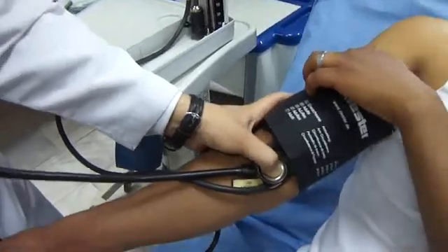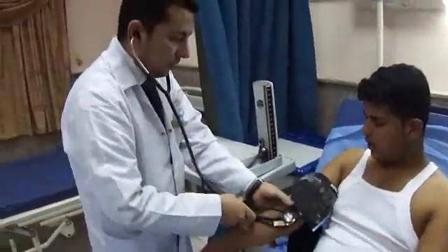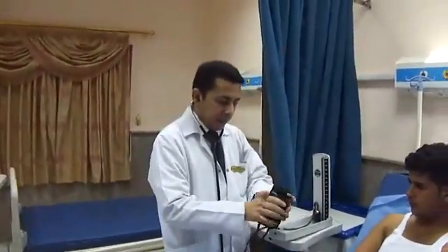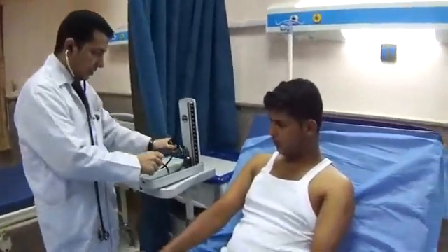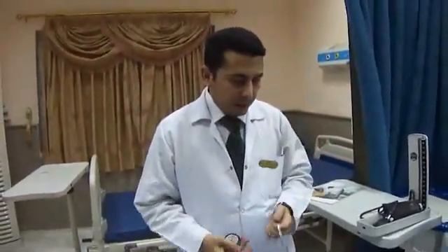The blood pressure sound has disappeared, which corresponds to the diastolic blood pressure. The systolic blood pressure was 130 millimeters of mercury and the diastolic blood pressure was 75 millimeters of mercury. Blood pressure should also be repeated after a period of about five minutes.